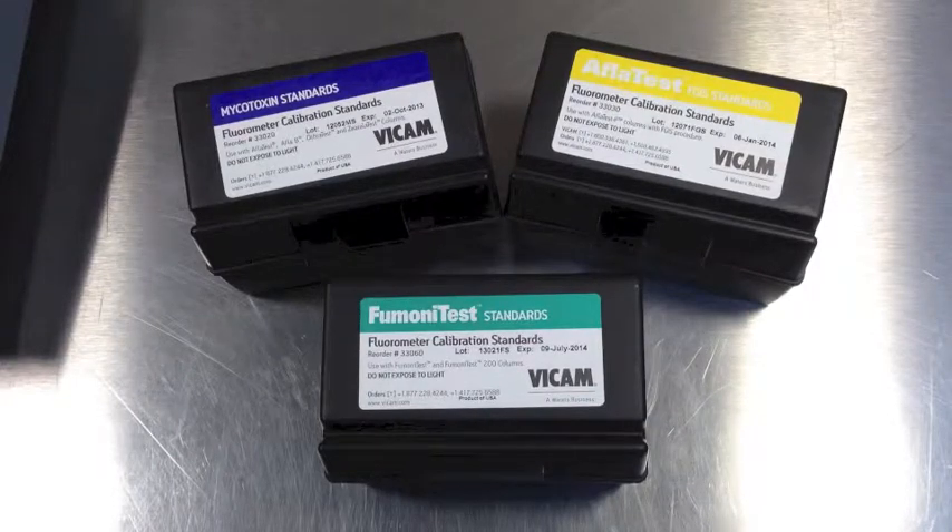Fumani Test has its own set of calibration standards. Use only the green labeled Fumani Test standards.